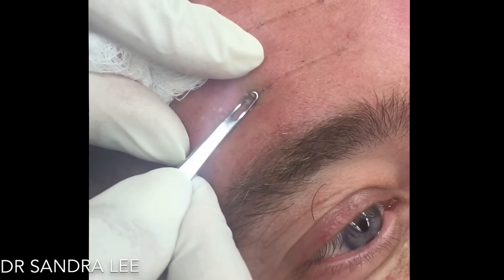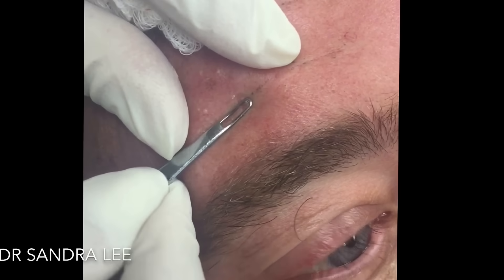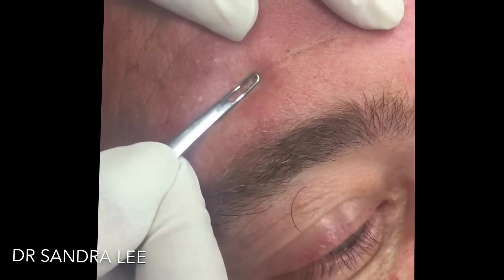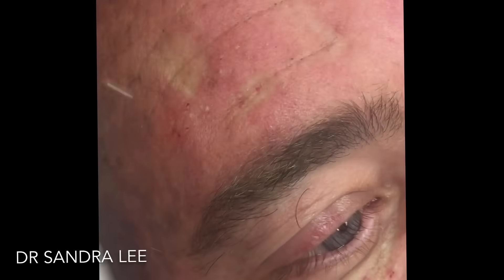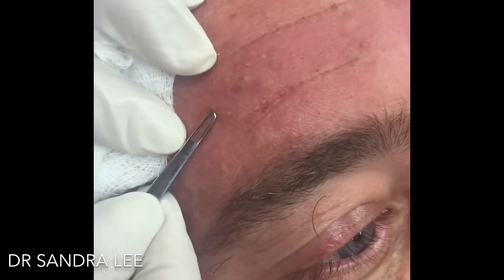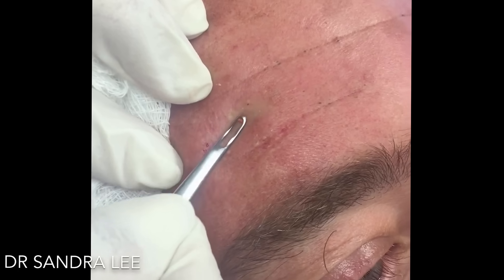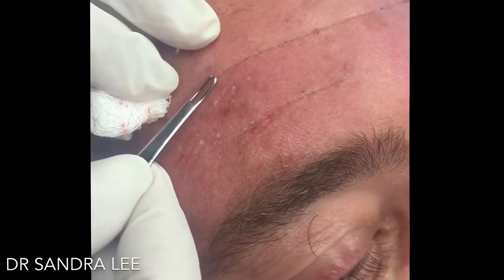What are those things on your head? I know, I don't know what they are. They're gonna be so jealous — not gonna be prettier than them. But I scrub, you know, like — it's not it's under the skin. I tried scrubbing. You have to use these special instruments like we have here that squeeze them out. We'll show you the video afterwards — you'll be pretty. I'm gonna try to get the black ones because I think those are the ones that you can see the most.